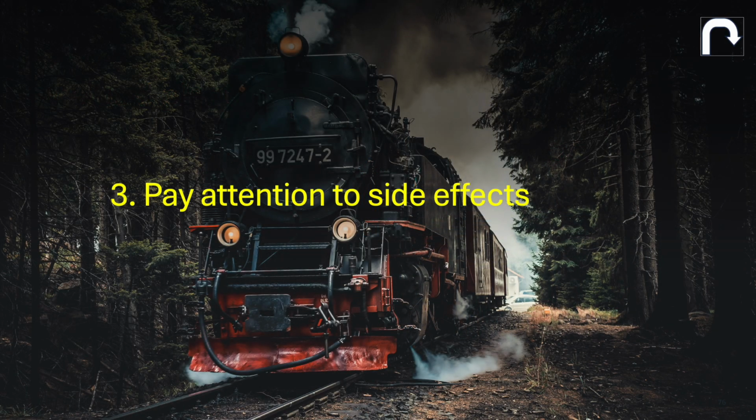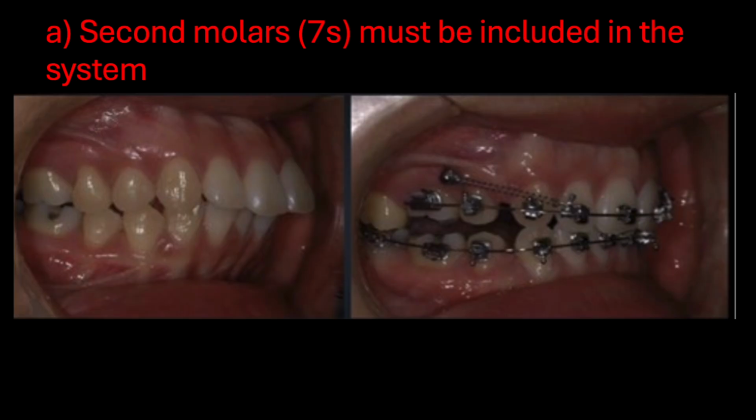When using full-sized arch wires, two things are crucial that we have to pay attention to. First, you must include the second molars in the appliance. If you don't, the first molars will intrude and tip distally, creating a severe step between tooth number 6 and number 7.